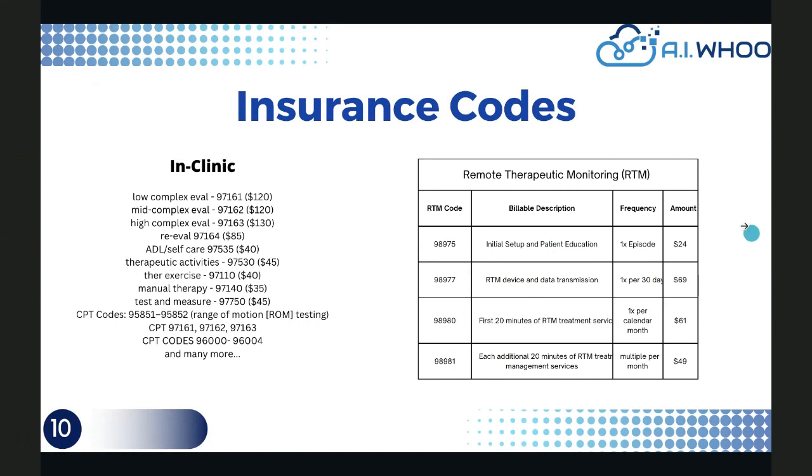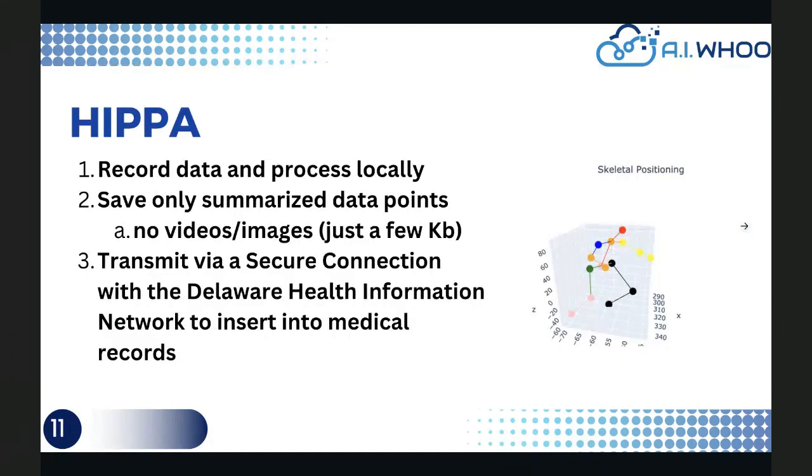We try to be HIPAA compliant, essentially. By putting a skeleton on top of the person, we're not saving people's images, and all the data is processed locally, right on the laptop, right on the phone. What gets communicated outwards is exactly this little skeleton over time.